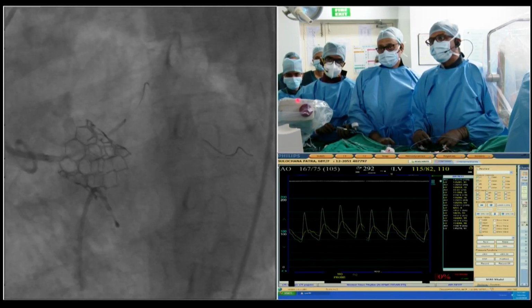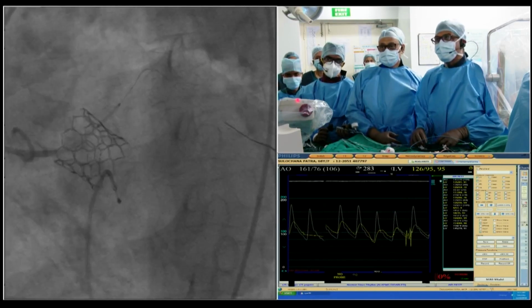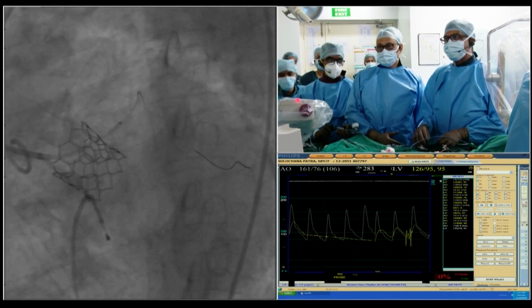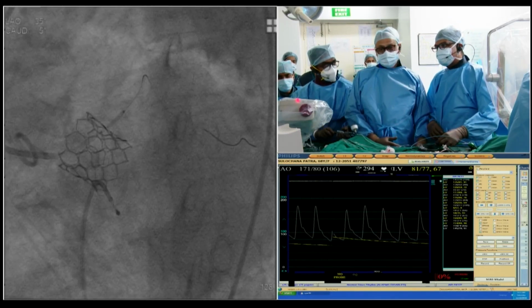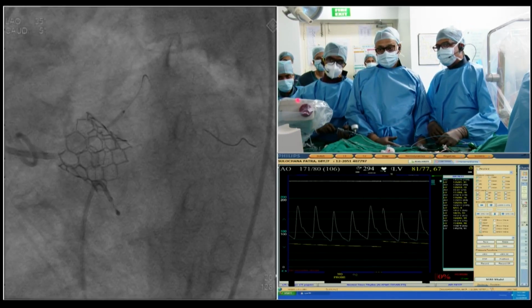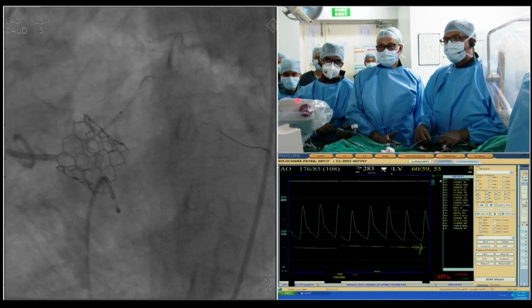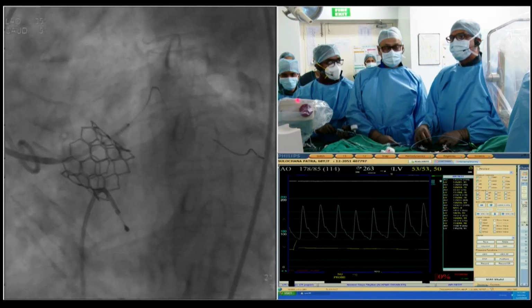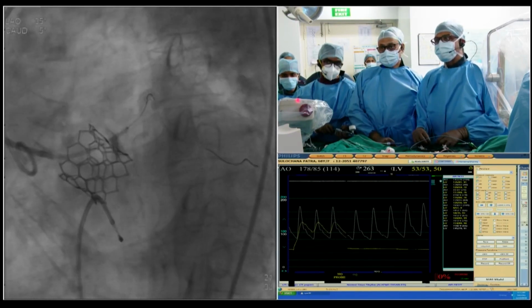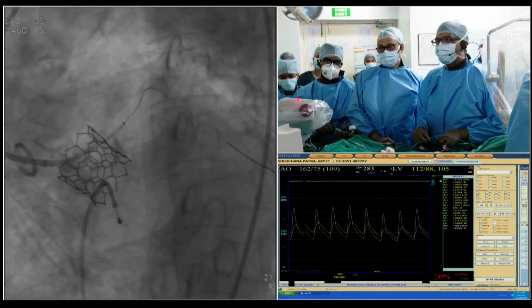The only thing is if somebody does a secondary intervention here, there's going to be a challenge with both the stent and the valve. But all the same, I think 1 or 2 millimeters outside the left main should be absolutely fine, and we will abut the valve leaflet also. I'll take an injection. The stent is slightly inside the marker, and I think that looks actually very good.